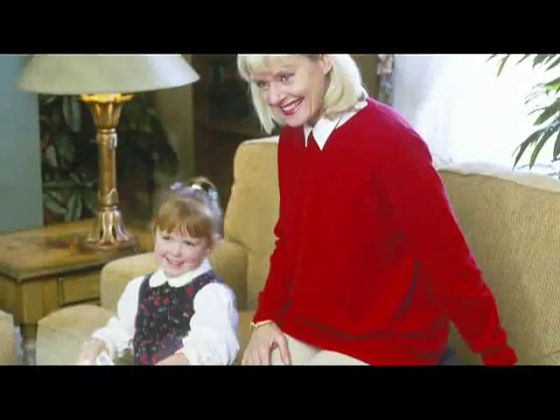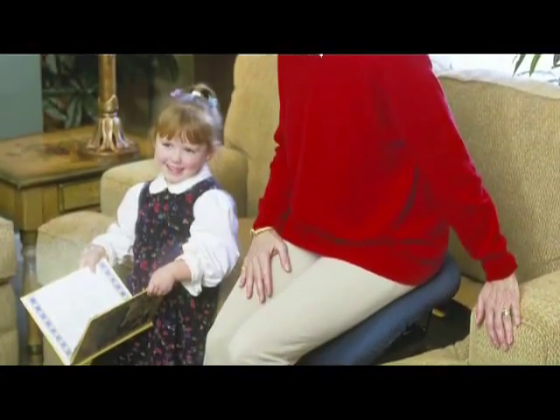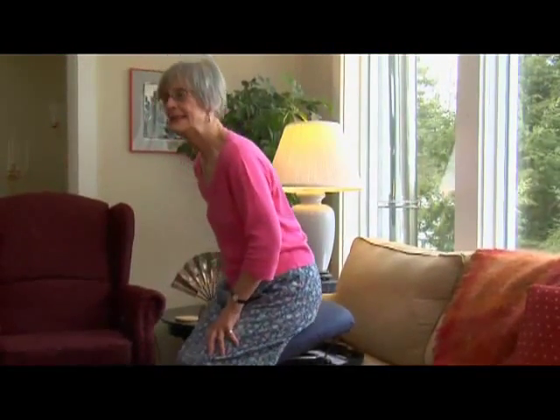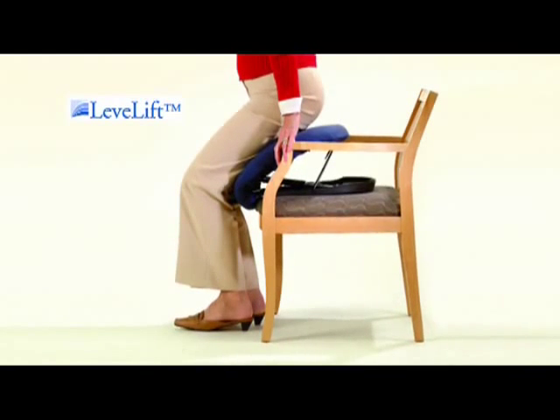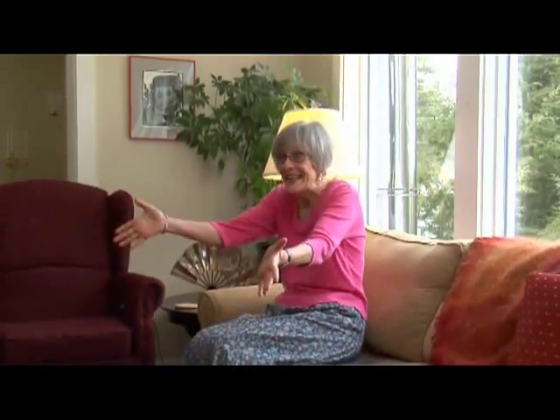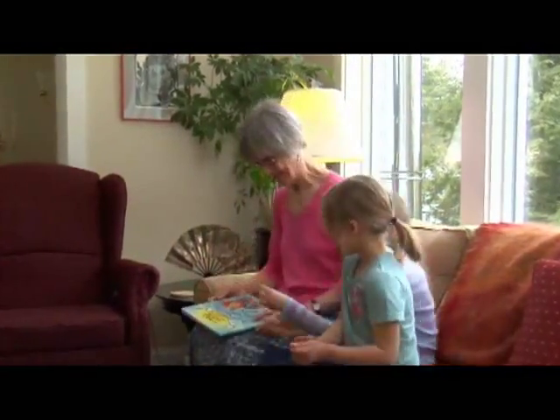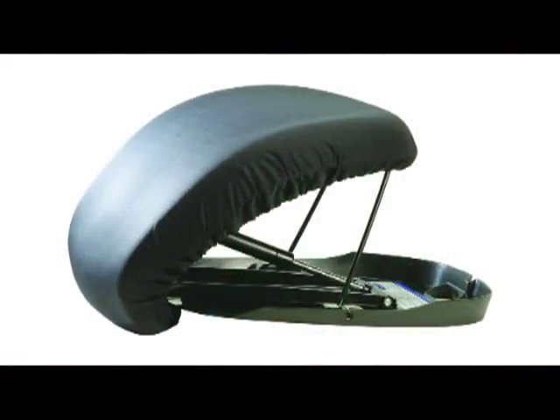Lightweight and versatile, the Seat Assist instantly transforms almost any armchair or sofa in your home into a helpful mobility aid. Designed for comfort and safety, the Seat Assist features the patented Level Lift technology — a flexible seat designed to move up and down on a level plane. For yourself or for someone you love, no matter your age, you'll appreciate the independence, comfort, and adaptability this safe and gentle portable device offers.